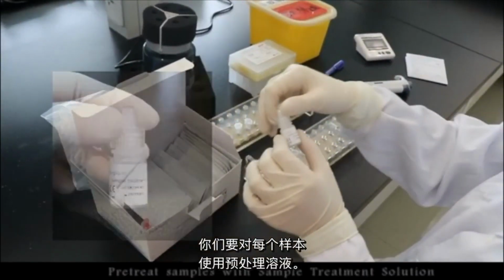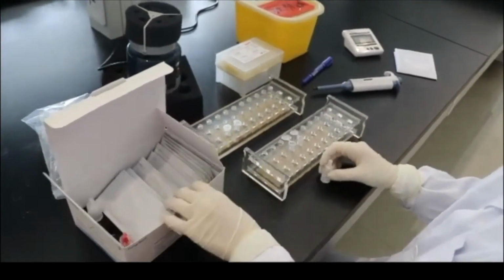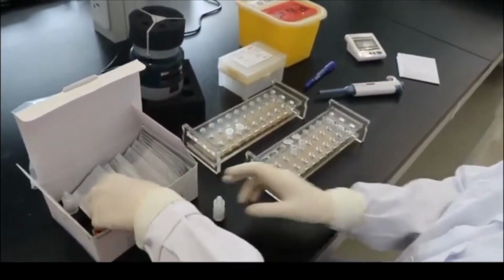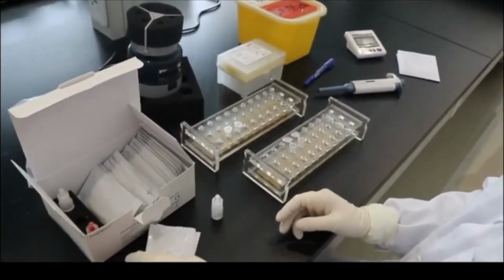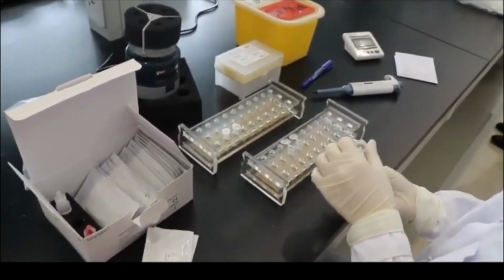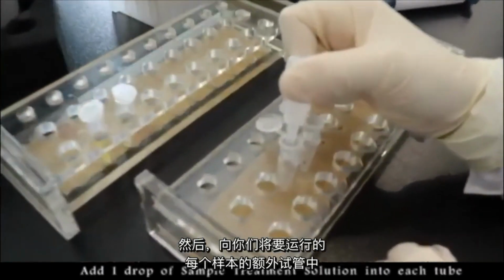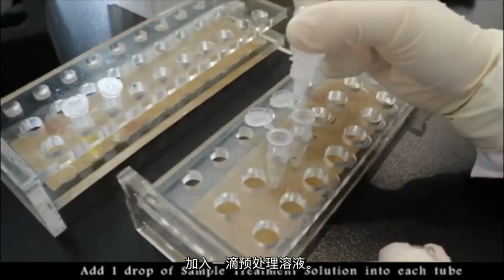You use a pre-treatment solution for each sample. And you place 1 drop of this pre-treatment solution into each additional tube for each sample that you will be running.